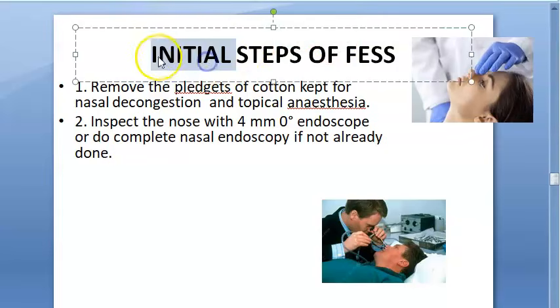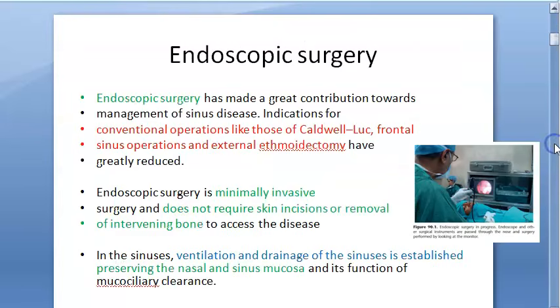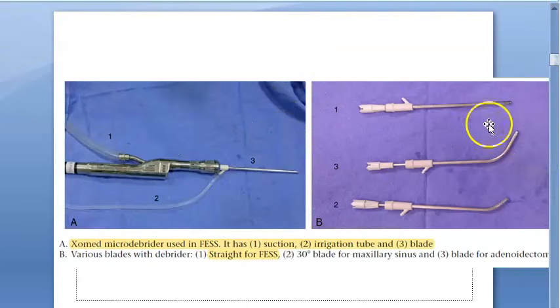Hello people, in this video we want to look at the steps of functional endoscopic sinus surgery. In the previous video we looked at what exactly functional endoscopic sinus surgery is. Basically, nowadays this is minimally invasive and performed, and it has replaced many surgeries. You have looked at why this is happening, because of greater technology, etc.